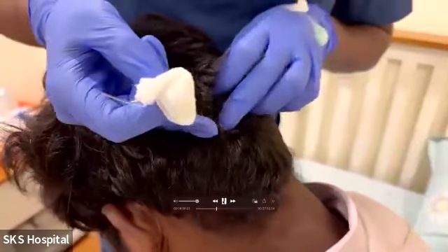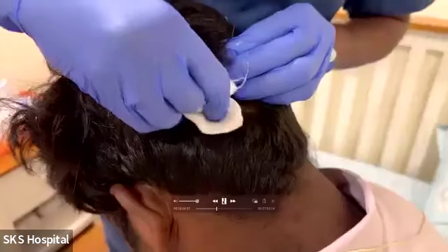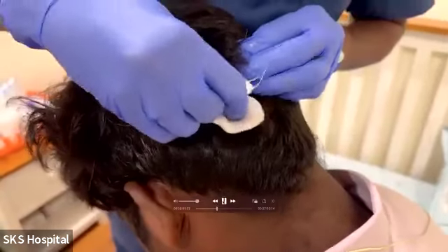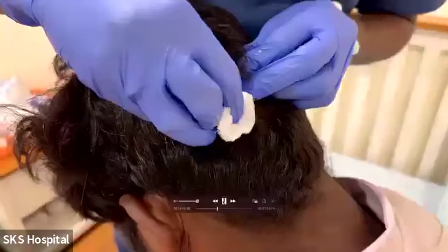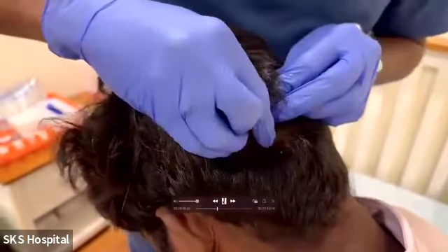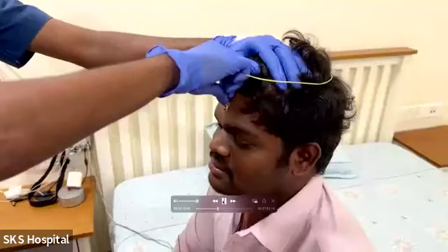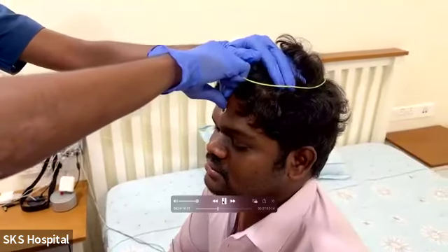This is the midline OZ point, sorry, the inion, and from there 10% would become the OZ. The patient we have connected today has not slept till now. I'm just waiting for him to get to sleep.